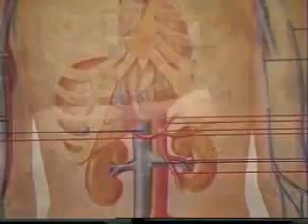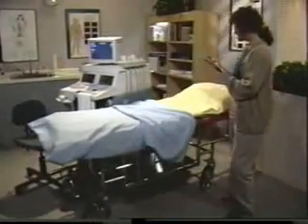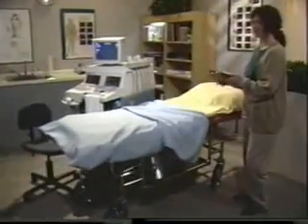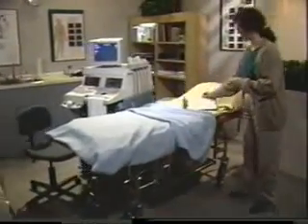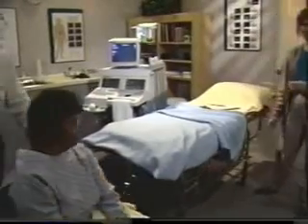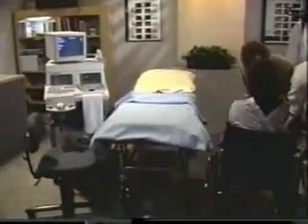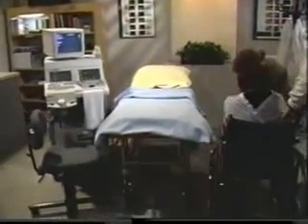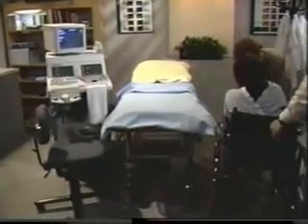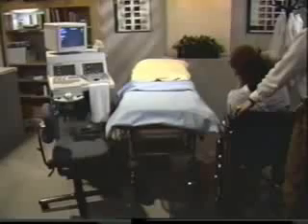The lower extremity ultrasound examination is an important diagnostic test for deep venous thrombosis, DVT. It can help identify any thrombosed venous areas or exclude thrombus as a cause of the symptoms of many other medical problems.